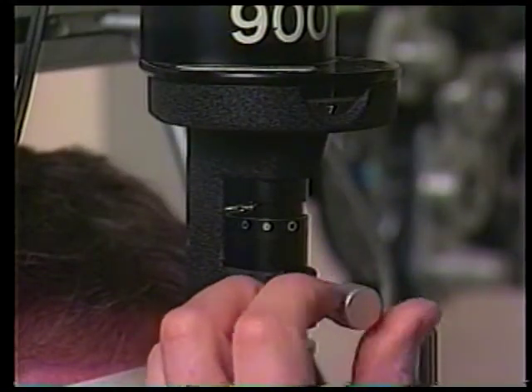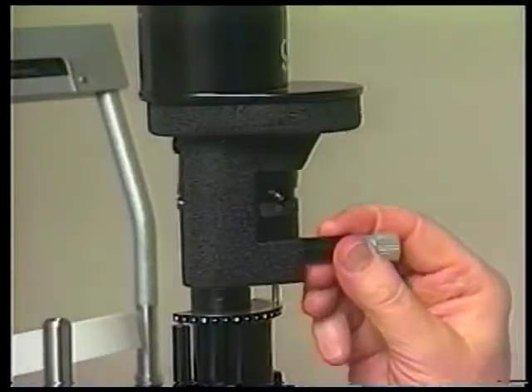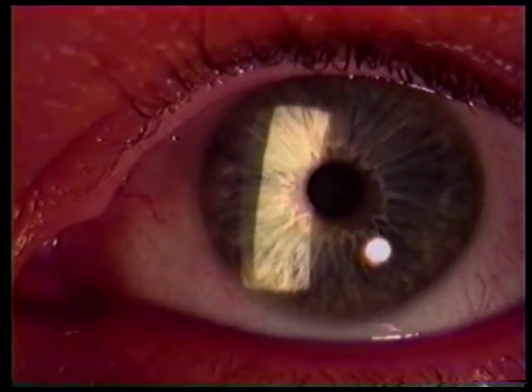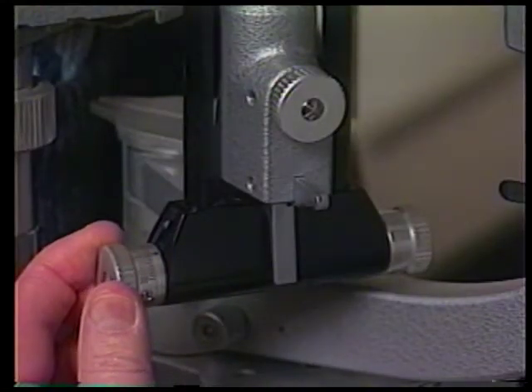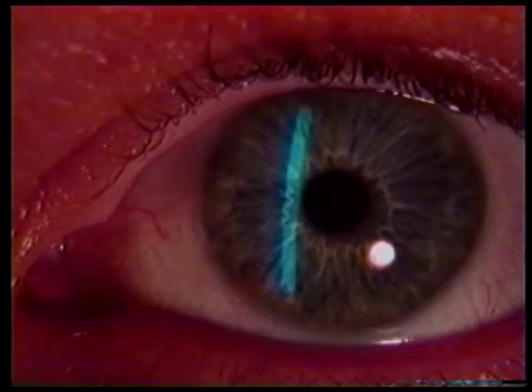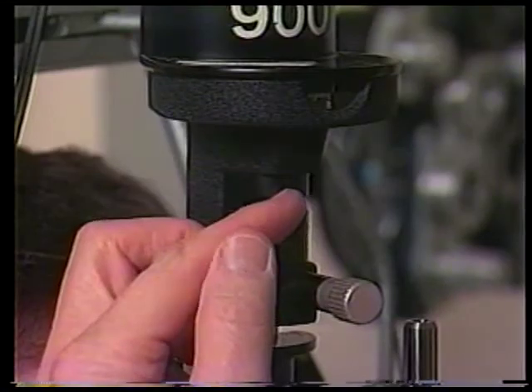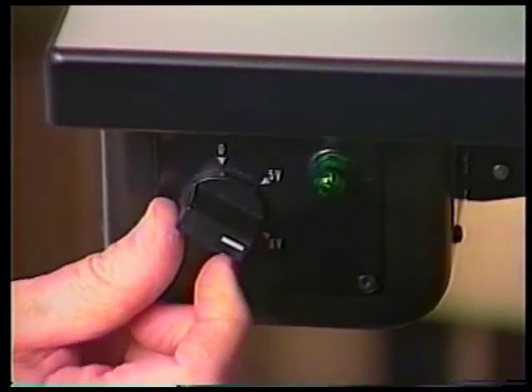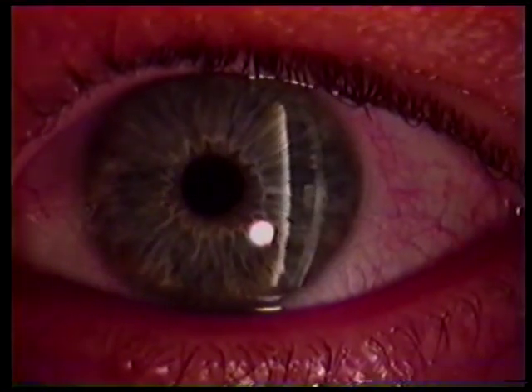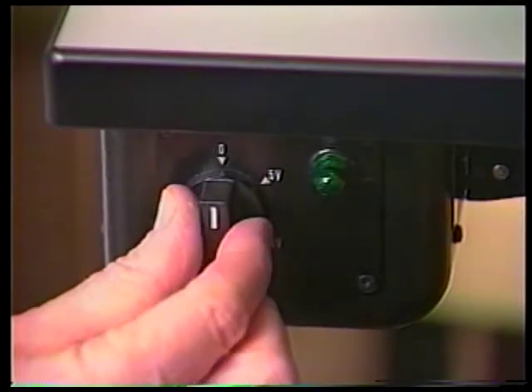Slit beam length is manipulated by turning the upper control lever knob. The lever also controls slit beam orientation or rotation. Slit beam width is controlled by turning the lower control knobs. Beam intensity and color are controlled by the transformer output and upper filter lever. Increasing the voltage from the standard five to seven and a half volts will double the lamp brightness, but it also significantly shortens the life of the lamp. Almost all examinations can be easily and effectively carried out with a transformer output set at five volts.